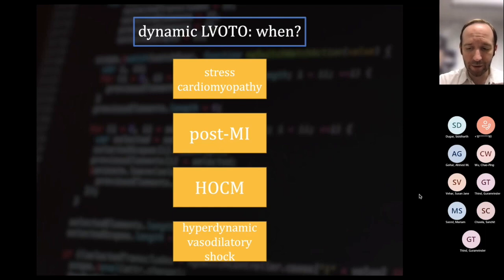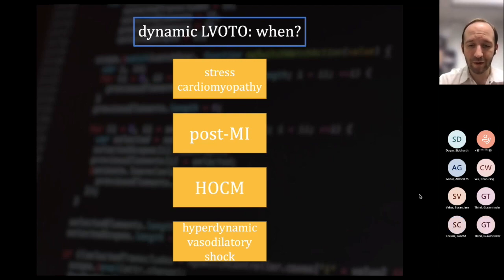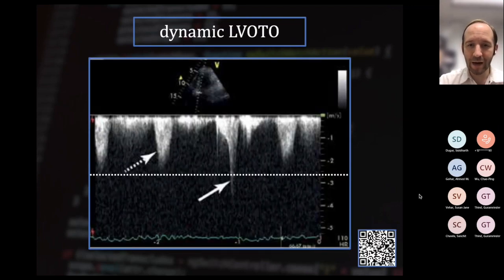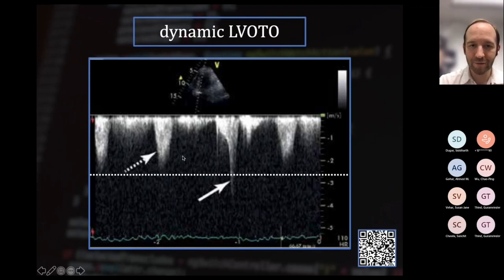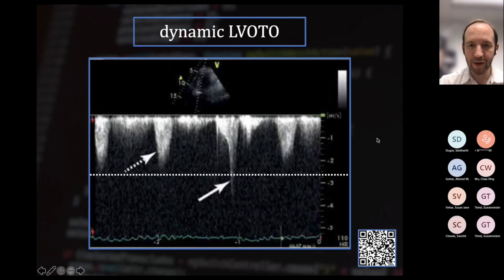If you think somebody is truly hyperdynamic, please look at their valves — make sure they don't have acute AI or acute MR, and do a survey for LVOT obstruction. On continuous wave Doppler, dynamic LVOT obstruction produces a fairly normal gradient across the aortic valve but then a really sharp sickling pattern — very abnormal, suggesting obstruction. That obstruction could be occurring at any point across that line: mid-cavity, in the LVOT, or the gradient could actually be in the ascending aorta.